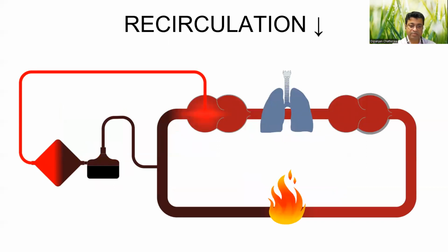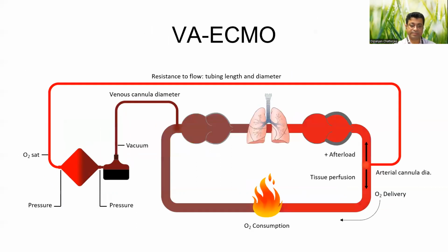In such a scenario, you have to increase the distance between the two limbs, that is, the venous drainage and the return cannula distance should be increased.